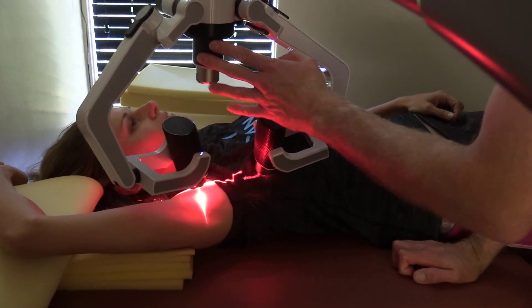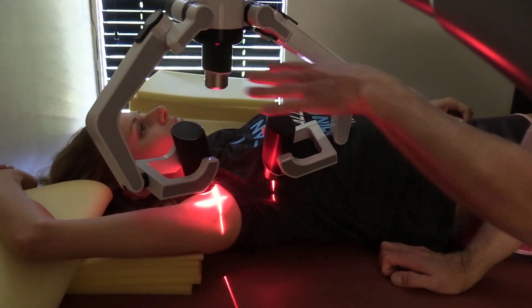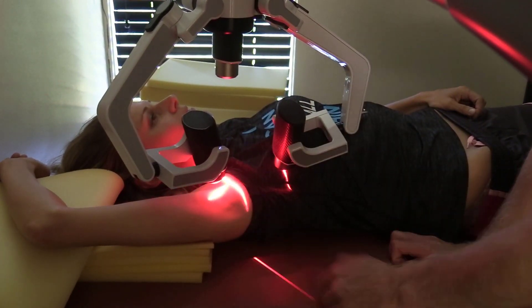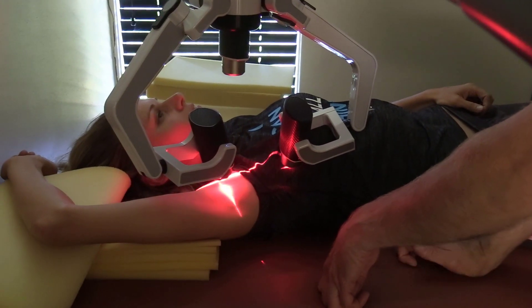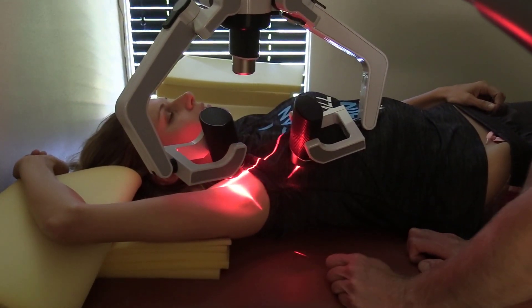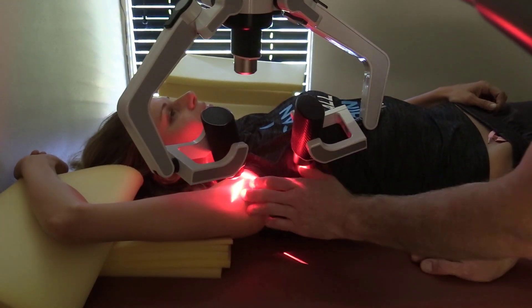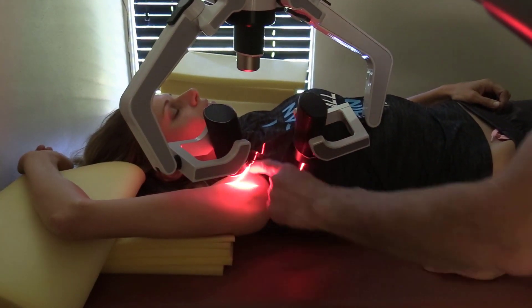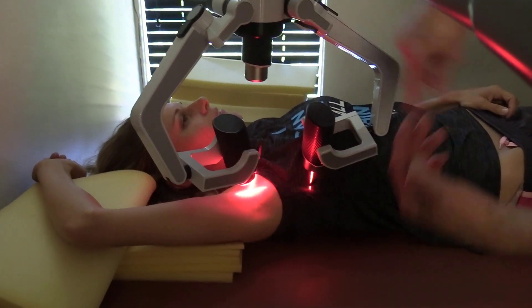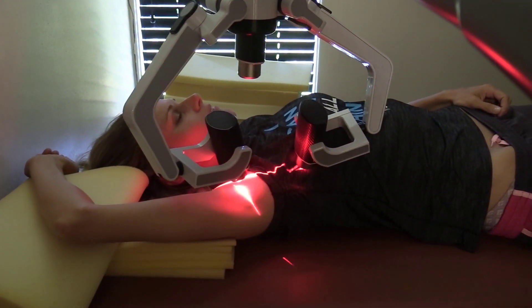With this device — the FX635 — this middle laser is high enough up where it's really not as effective as it could be. The way it's built, if this thing could lower down another six inches, it would be even better. But these two are doing the primary treatment right here. It's not saying the middle laser is ineffective — it's just higher up and covering a larger surface area, but not very well.